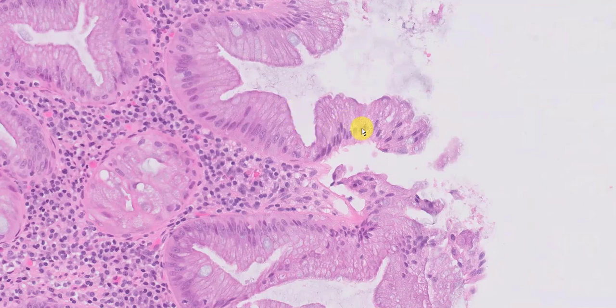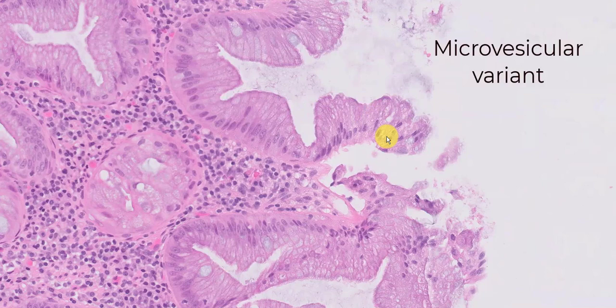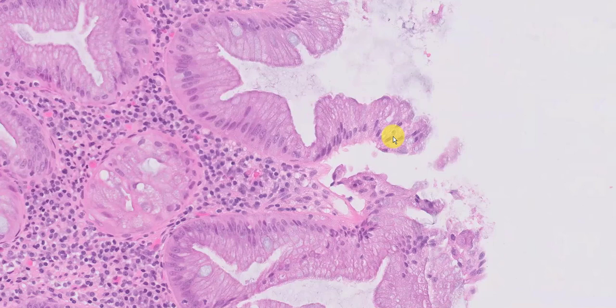The epithelium, particularly on the top, shows a very hypermucinous appearance. The cells are filled with microvesicular vacuoles — this is the so-called microvesicular type of hyperplastic polyp. These cells are thrown up in little tufts, what I sometimes refer to as that very frilly edge to a hyperplastic polyp, and that's another very characteristic feature.